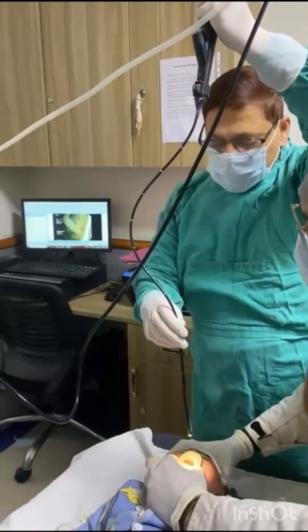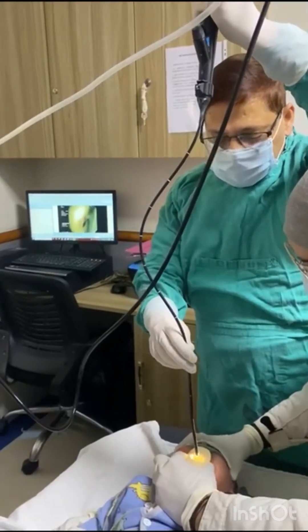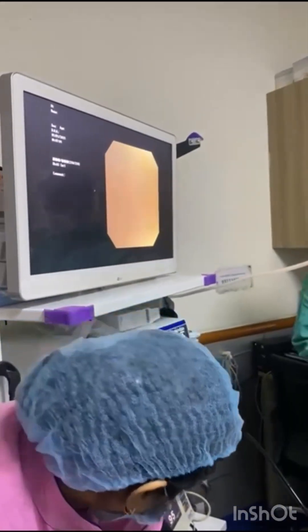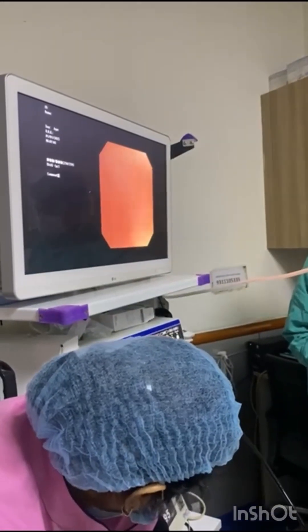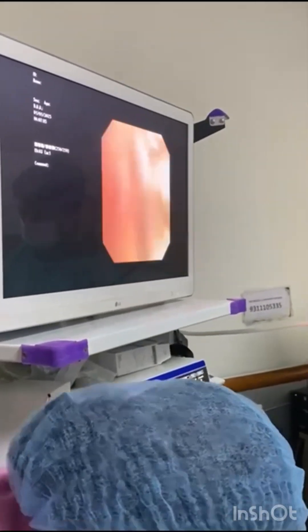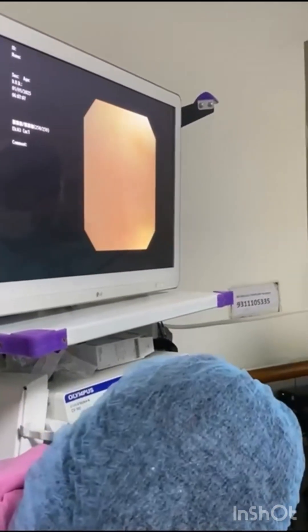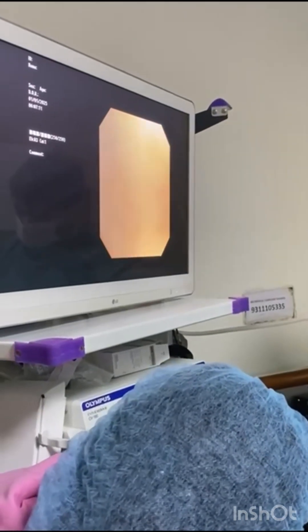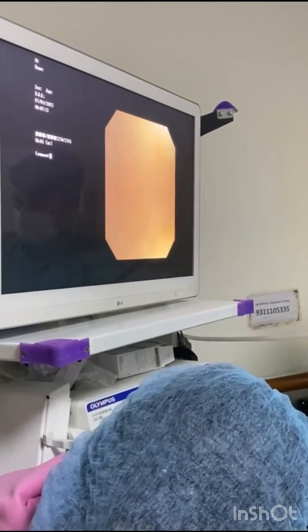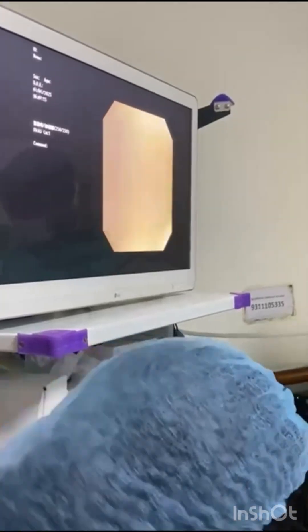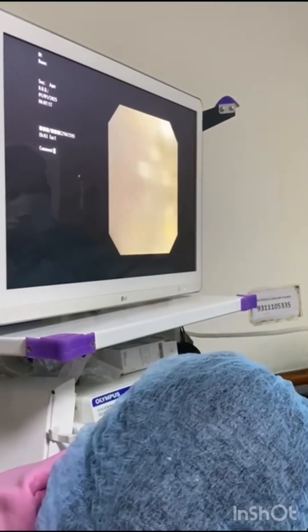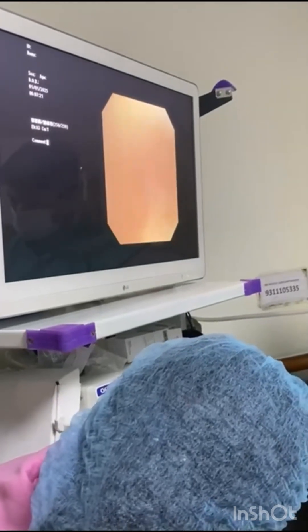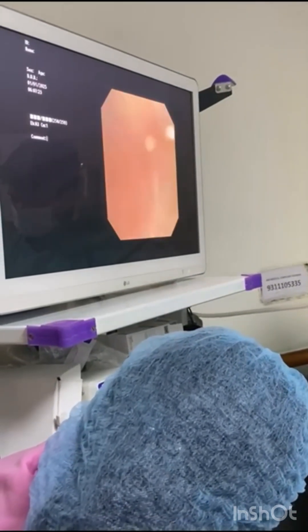To confirm, I will perform an endoscopic examination of the airway using a flexible bronchoscope to inspect the airway, mainly the larynx. I have inserted the scope and the tip is in the throat, but nothing is visible. When nothing is visible, don't pass the scope — just retract it to look for the desired structure.